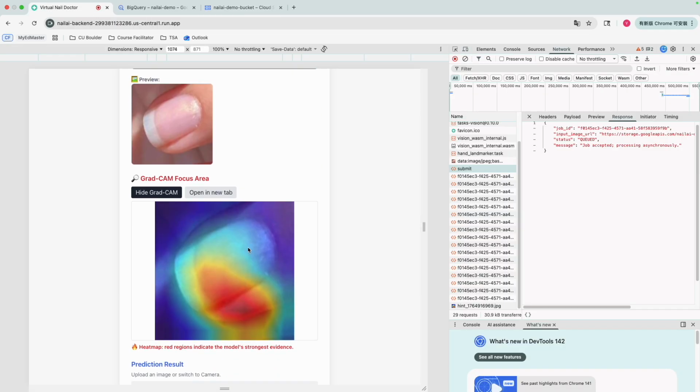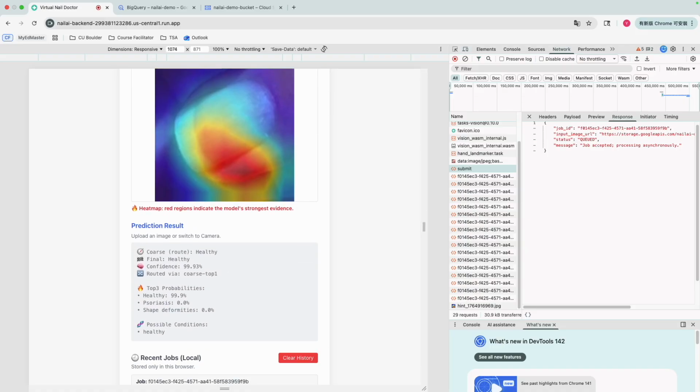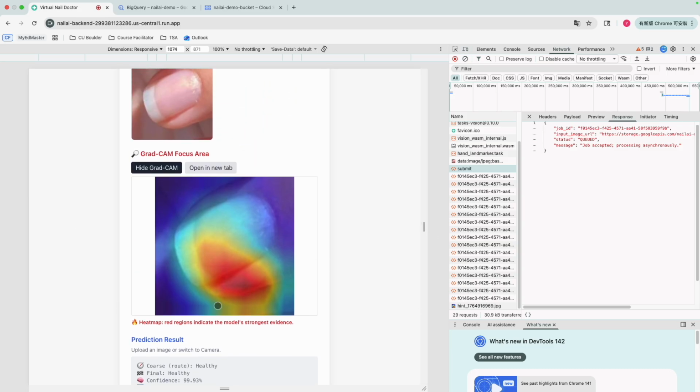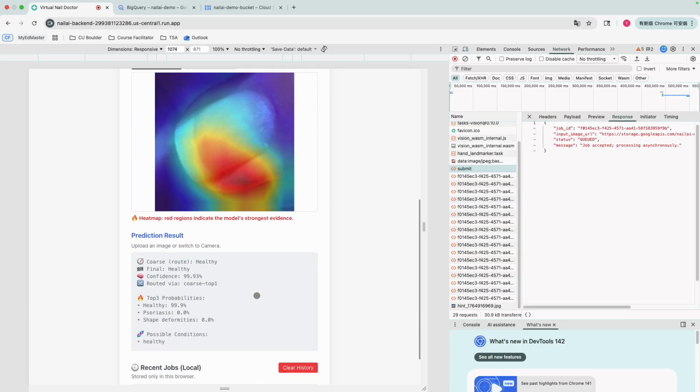Okay, now as soon as the worker completes inference, the final results appear here. We can see the coarse disease category, the final fine-grained prediction, the confidence score, and the routing path it took inside the hierarchical model. And there's also a Grad-CAM heat map that highlights the exact nail region the model relied on. Then I can choose to view it or open it in a new tab. So we can see the nail focus on this plot, so it predicts this nail is healthy.